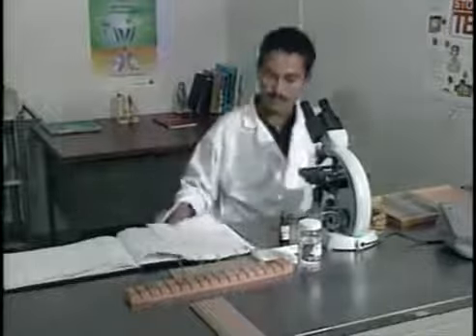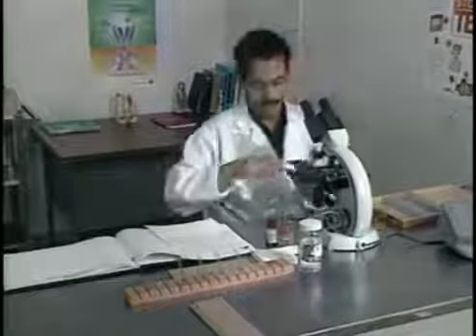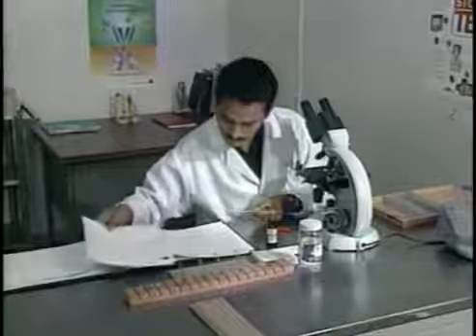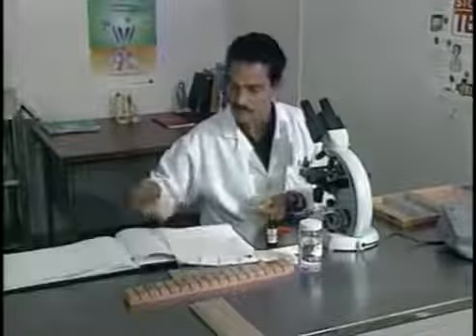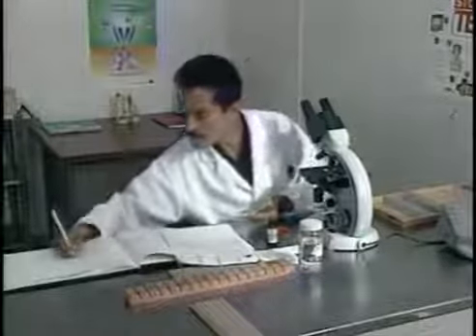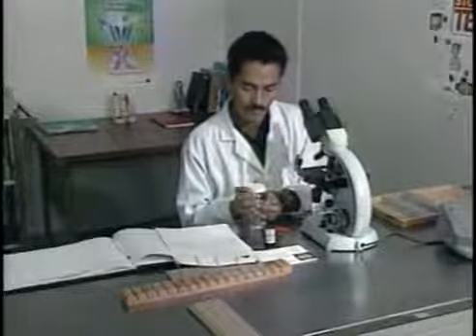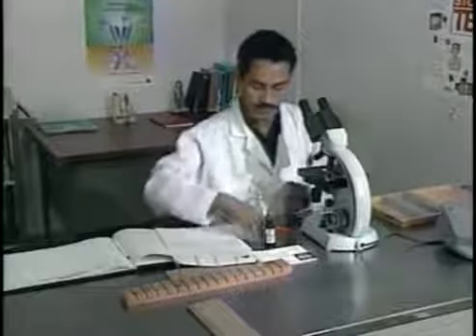After examining the slide thoroughly, remove it carefully from the microscope stage. Check the slide number again and enter the result immediately into the lab register. After completing the reading, remove the oil from the slide with organic solvent.